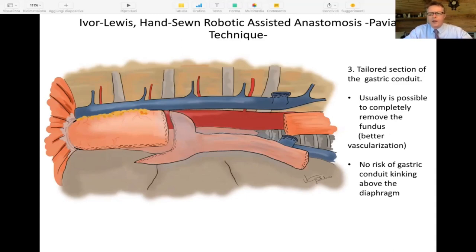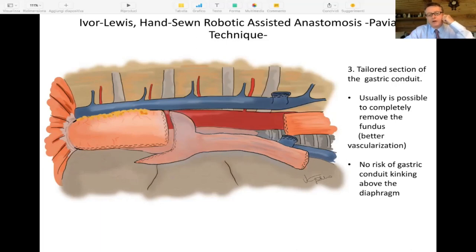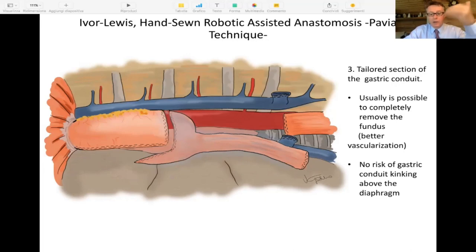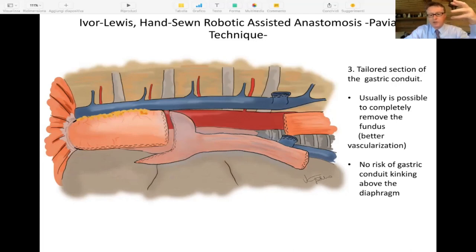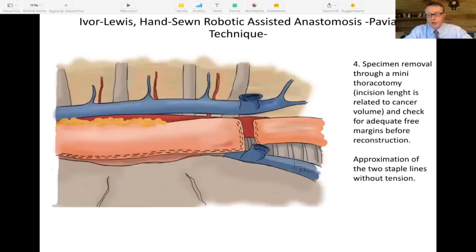Once we are in the chest, we section the gastric conduit in a tailored fashion, varying from one patient to another. Usually it is possible to completely remove the fundus of the stomach, which is good for two reasons: the fundus is not the best-vascularized part of the stomach, and it is slim. By using the body of the stomach for the anastomosis instead, the thickness compares better to the esophagus. Also, if you make just the right dimension of the gastric conduit without excessive length, you reduce the risk of kinking above the diaphragm that can sometimes cause vascular impairment.